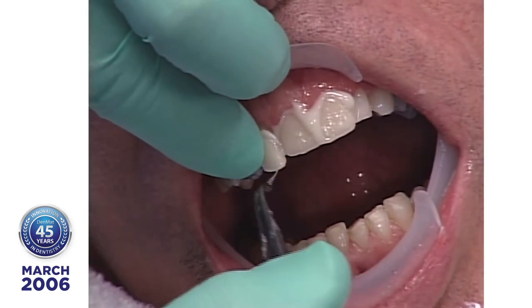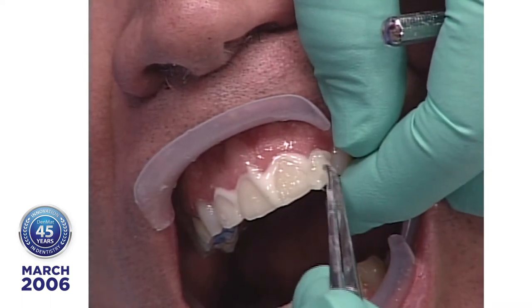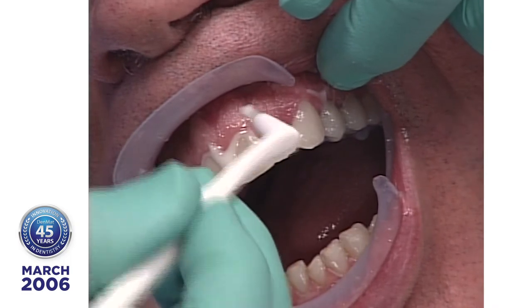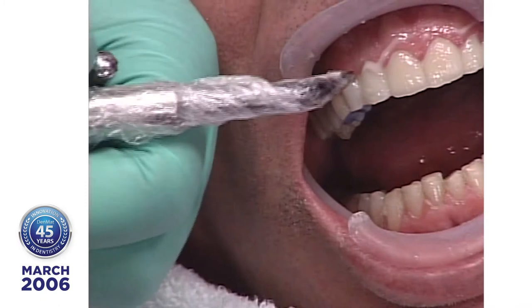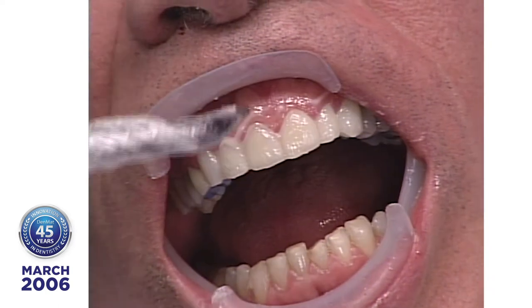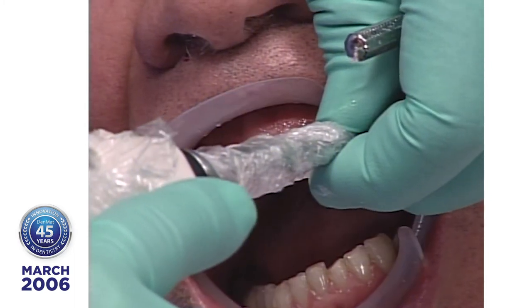And the other reason I don't like to look at them on try-in is because all the margins are open. There we go. And I'm using a brush to gently remove this. And I want to make sure that when I place it on there, I don't place it hard, but I see excess oozing out around the margins. And as long as I see that, I know I have what? Enough ultrabond between the tooth and that.